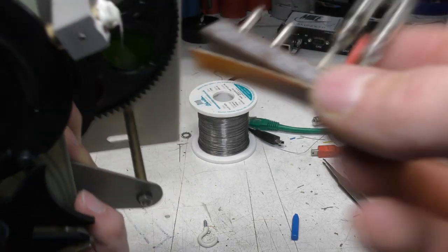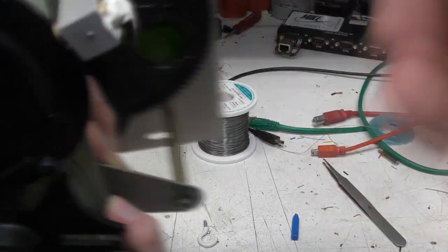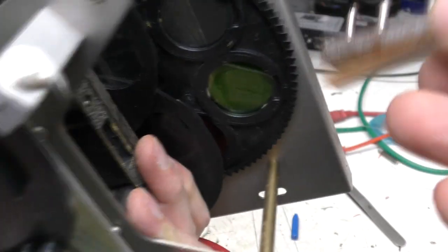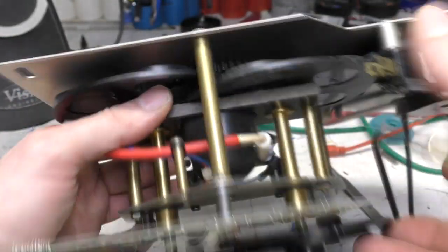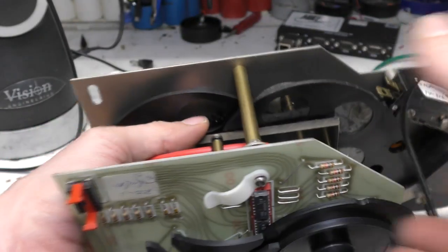Considering the actual trigger transformer, which we'll see on the main board, is quite small, it's just really poor design to not mount that either on this part here or perhaps this base here. Maybe on here, if this is a replaceable part, you wouldn't mount it on there, but they could certainly have mounted it on this socket and then had a relatively low voltage signal up to trigger it. So that's not too impressive.